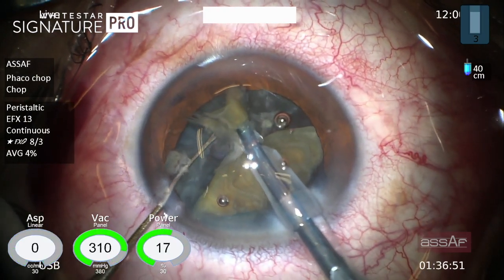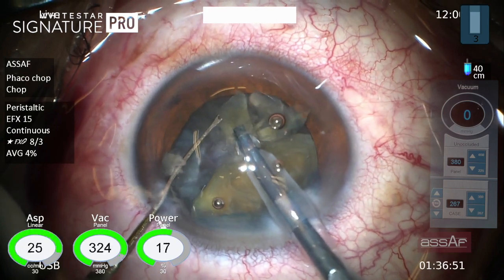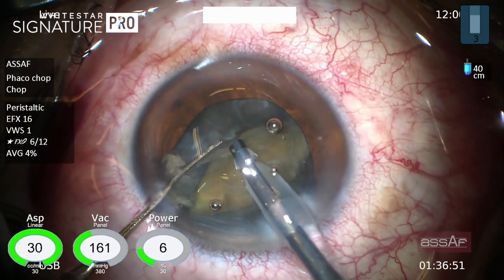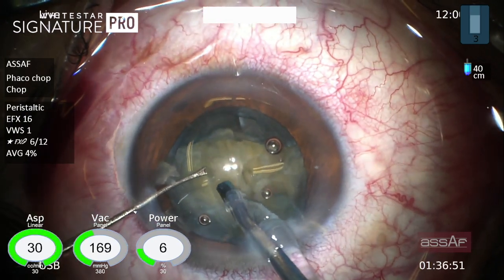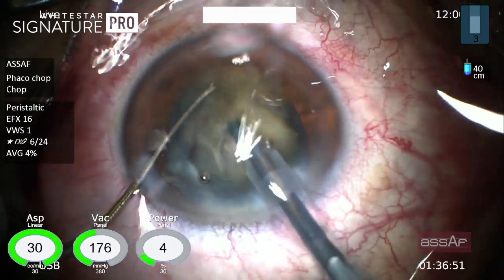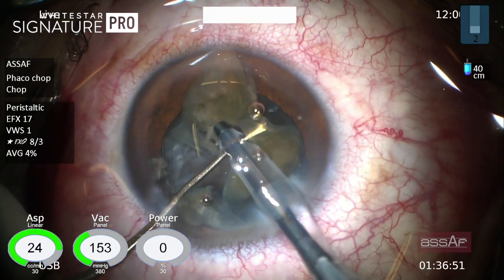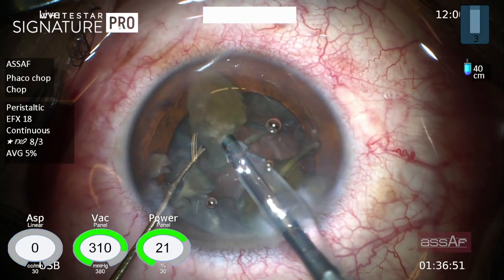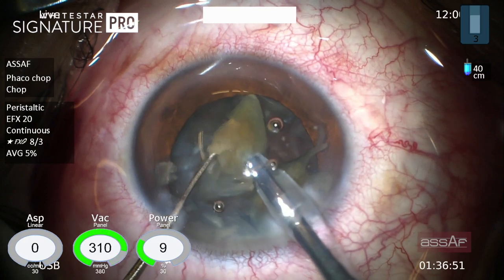In this FACO platform we can set two levels of vacuum. An initial high vacuum for better holdability of the nuclear fragments against the phaco tip during ultrasound activation, and after a preset time this high vacuum automatically reduces to a lower preset level before occlusion break. This improves the stability of the anterior chamber during phaco emulsification.